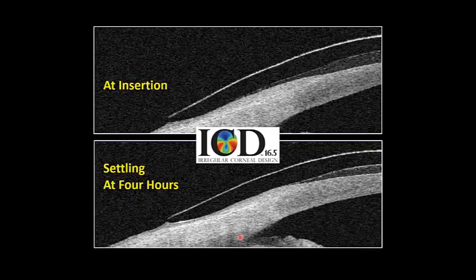So is that a problem? Do we need a toric landing on the scleral lens? And the answer is no. The reason is that as the lens lands on the surface of the eye, it's going to sink into this soft, very boggy conjunctiva, and as it sinks in, it's going to take out whatever toricity is generally present. So you typically do not need a toric back surface in an ICD lens or any scleral lens because of this soft tissue that it's landing on.